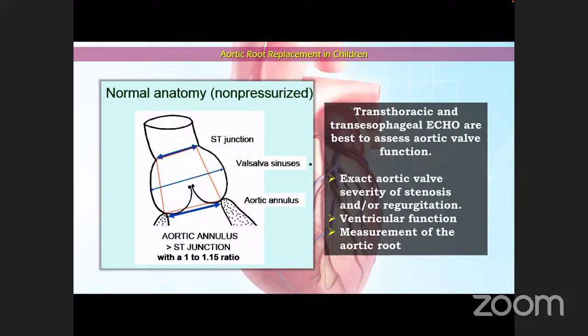And this is also good because echocardiography is an excellent modality to assess the function of the aortic valve and judge the amount of regurgitation. It also can tell you about the ventricular function. Again, you can use it in the operating room much easier than any of the other modalities to check on your repair, particularly if you repaired the aortic valve in these patients.